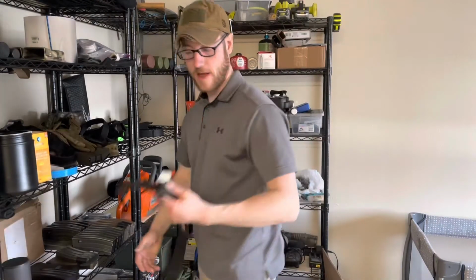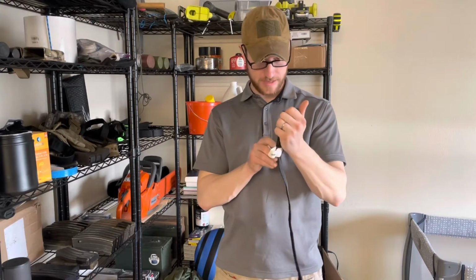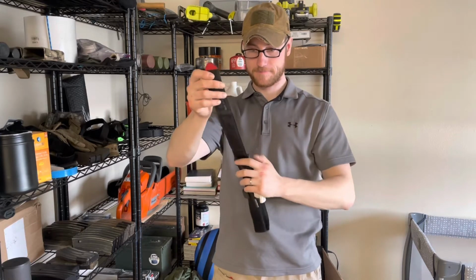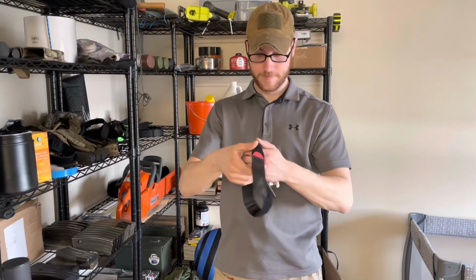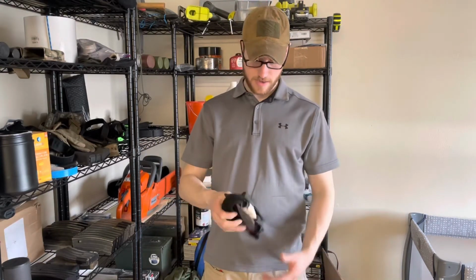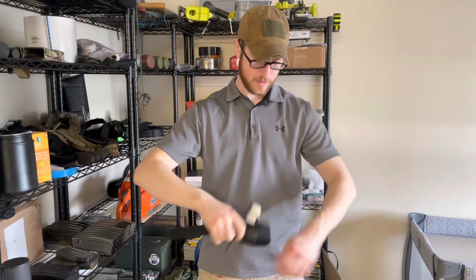Alrighty guys, so now we're going to talk about putting it on an arm. This is when you really do need to have it set up for one-handed use, because obviously you can't use two hands putting it high and tight on an arm. It won't work. So go ahead and get this all set up. You're going to have your tourniquet, and we're going to go left arm. You're going to get your band, put it over your arm. Let's go the other way, make it a little easier on us.